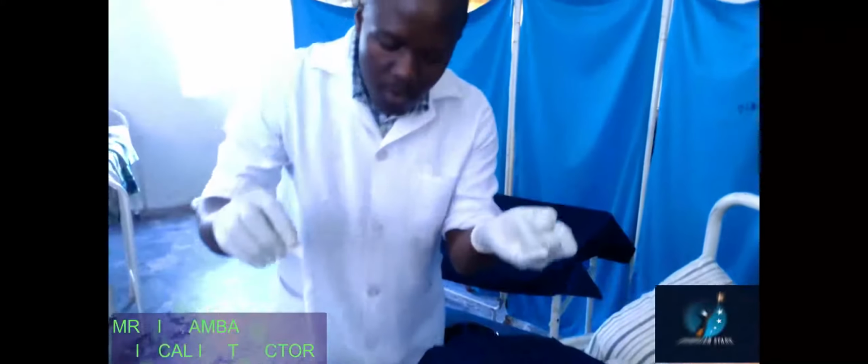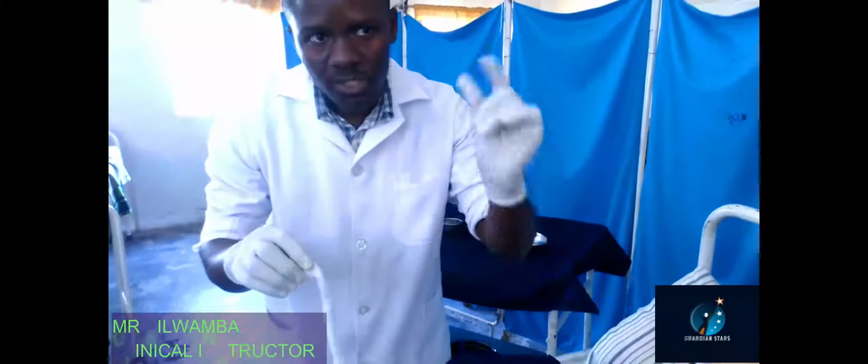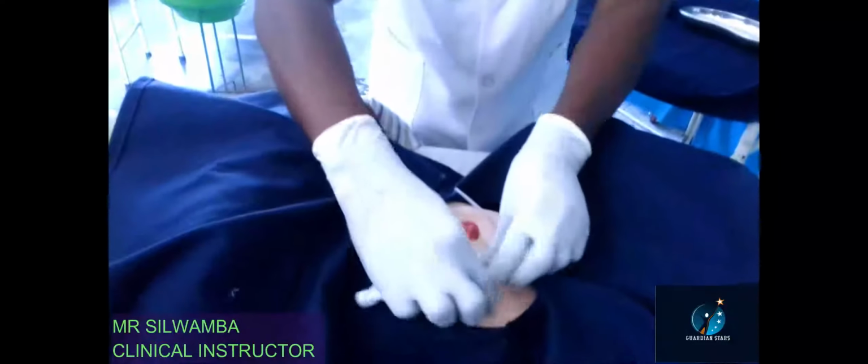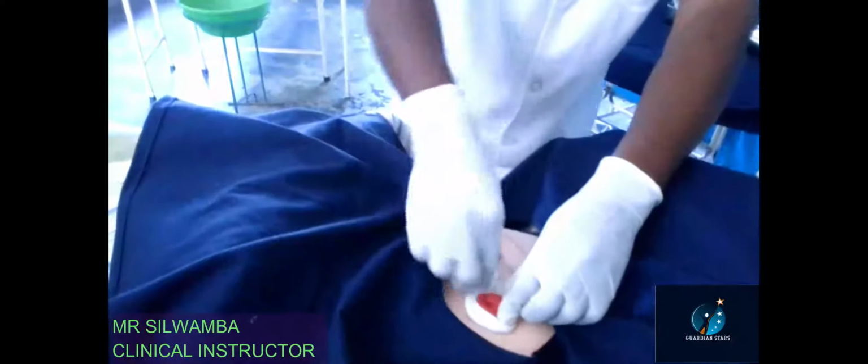So that's why you have to get this gauze, because glue and Vaseline will not stick together. So you get this gauze, which is dry, and place it round the stomach.